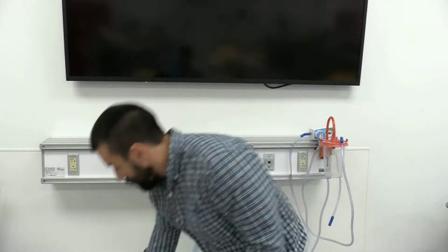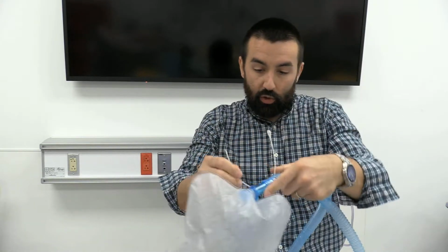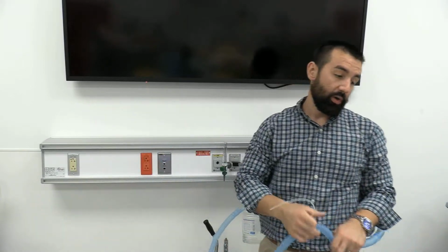They make some other ones that are just like this little piece of plastic and it slides through, and then you can snug that up and run it through this top piece and loop it onto the bed. Okay, so you want this in a downward position, and you want it at the lowest point of the system. Otherwise, water builds up and it's not really serving its purpose here.